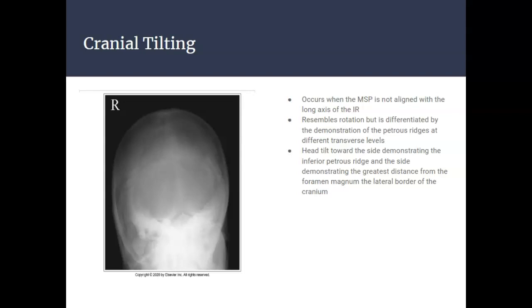To correct tilting, ensure that the MSP is aligned with the long axis of the IR. Also, taking a look at the sagittal suture — if it is not aligned with the long axis of the IR, that should indicate there is some type of rotation or head tilting occurring.